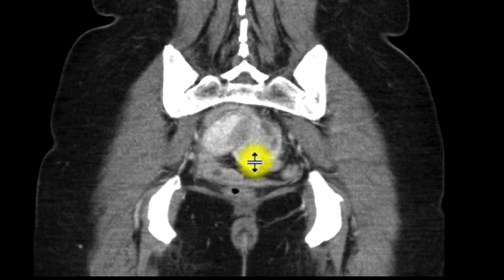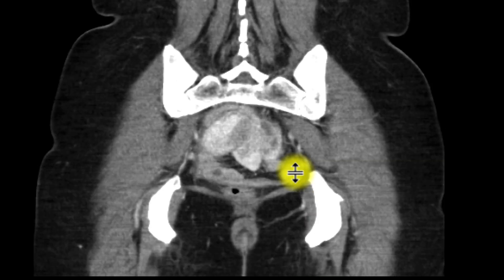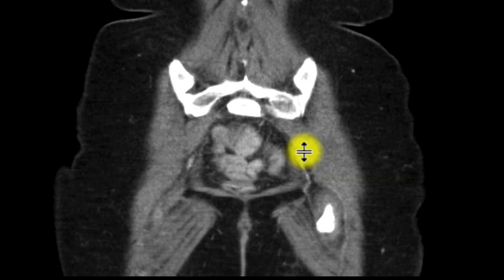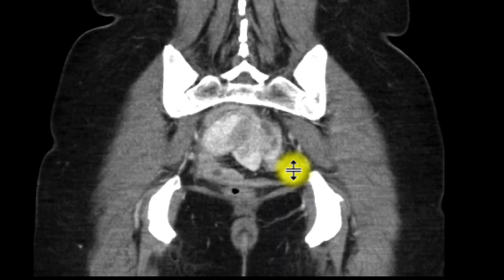We can see it right over there, this filling defect. And so this ended up being resected, and this turned out to be an adenocarcinoma of the small bowel.